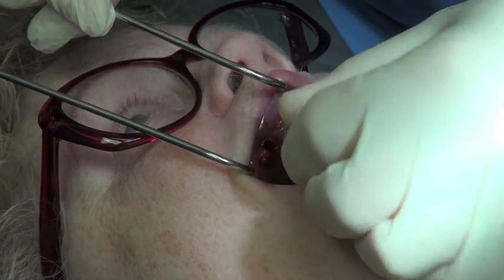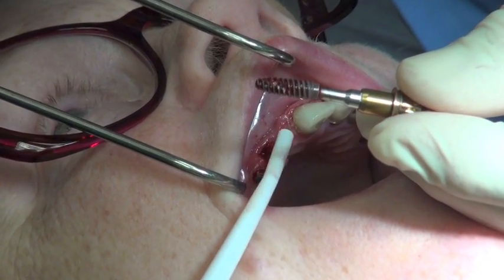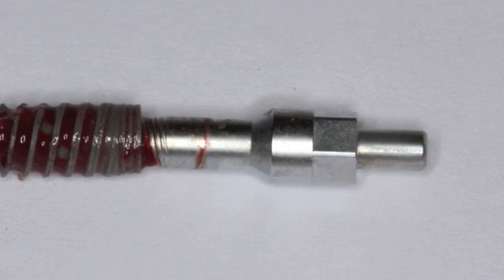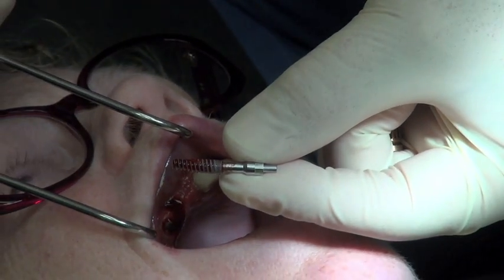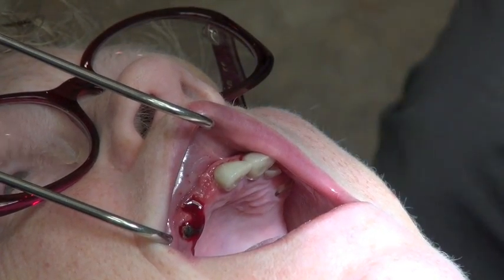It's a great tool to have in your kit because you can let things heal or go ahead and do an all-on-four. You can see this tool is kind of fused and welded into the implant and hard to get out — you actually need wrenches to get it off. I would just use a new one each time you try to remove an implant because it's worth it to have these in your office when you need them.